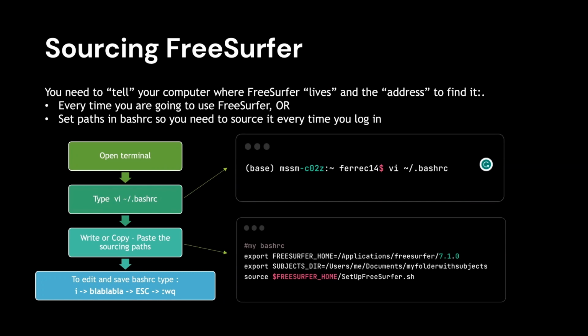Or the other way is to set the paths in your bashrc, which you probably heard about in the bash video. You set the paths in your bashrc, and basically your computer will read that document and source it every time you log in. So you don't need to do it every time you're going to use FreeSurfer.